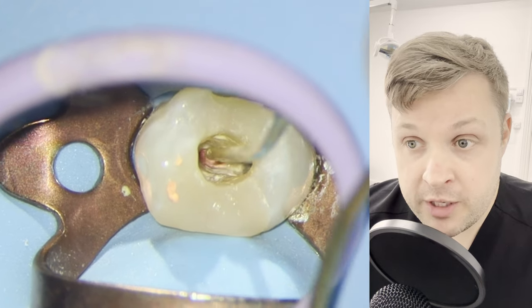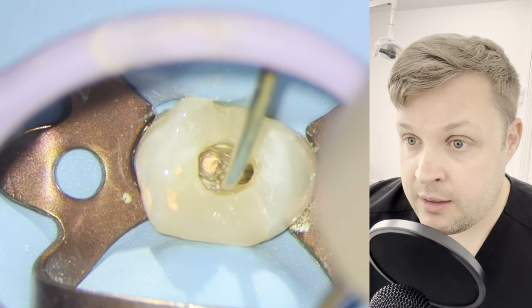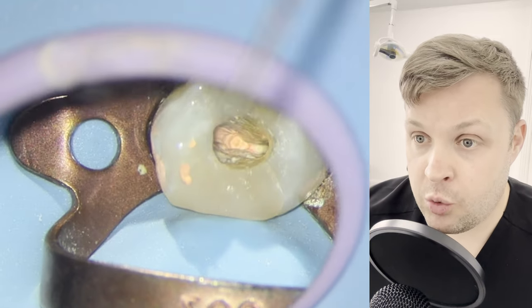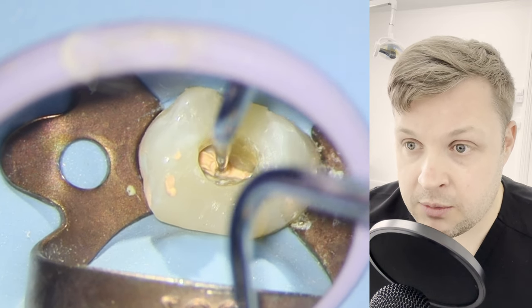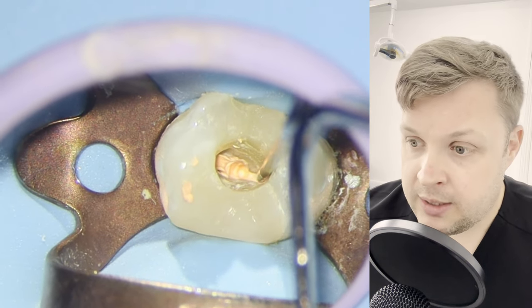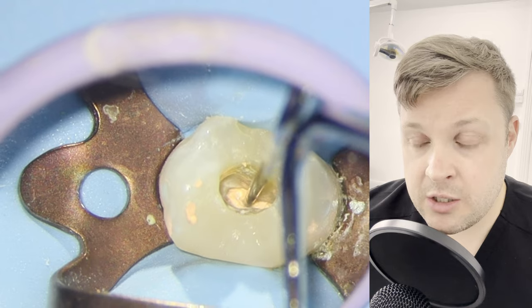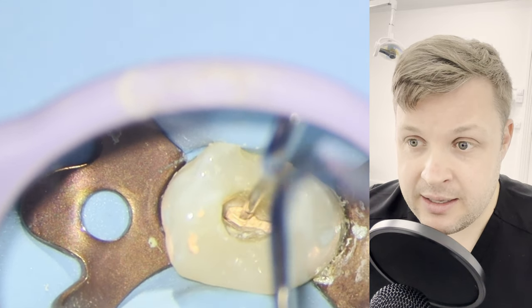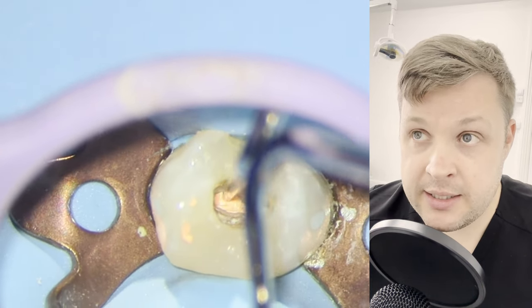I noticed the GP has stuck nicely to the sides because it's not a completely circular canal. Then I'm going to use a B&L warm gutta-percha unit to backfill the remaining space in the canal, and then use the MAK2 pluggers to give it a good compact down. I always say this in all my videos — I used to be really sheepish about compacting down the GP; I used to be super worried about extrusion of my obturating materials. But now with a bit more experience, as long as you've got the apical diameter correct, you're not going to extrude any obturating material if you've got the correct diameter on your cone.